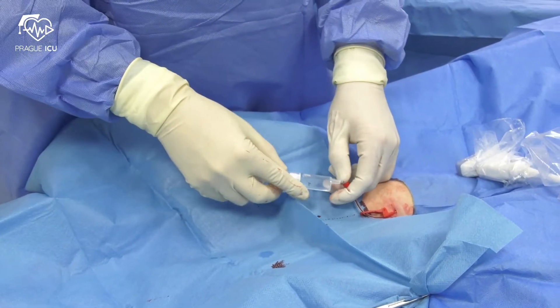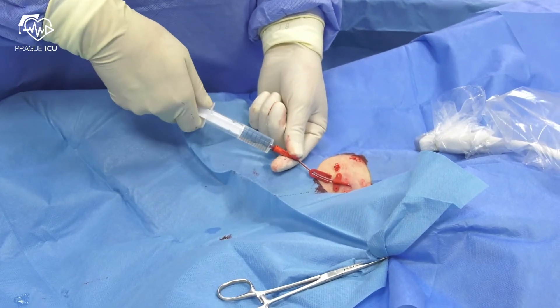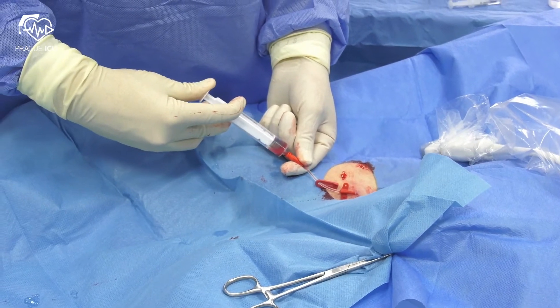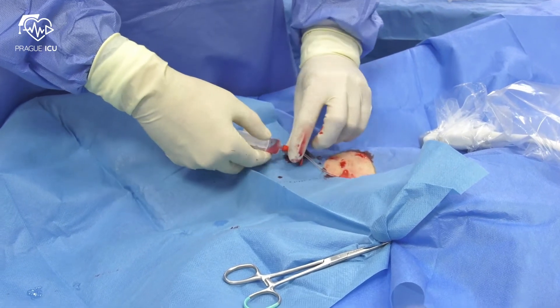Remove the wire and check the blood return in the port. Aspirate and flush the lumen. Reclamp and apply a lumen cap.